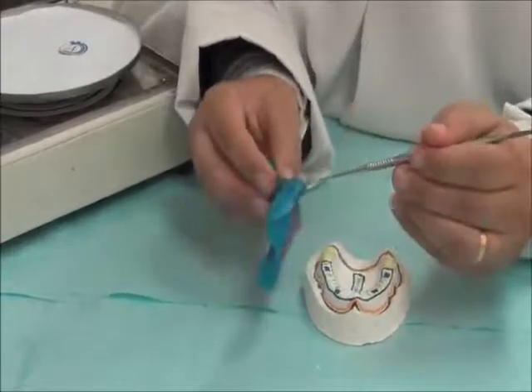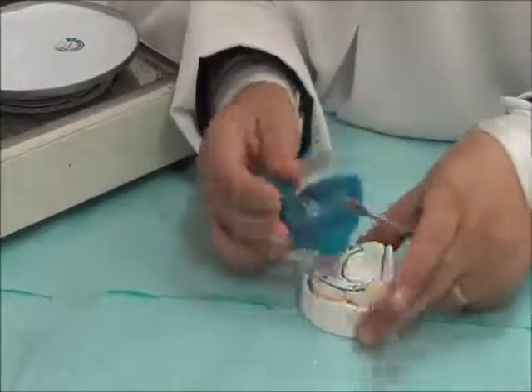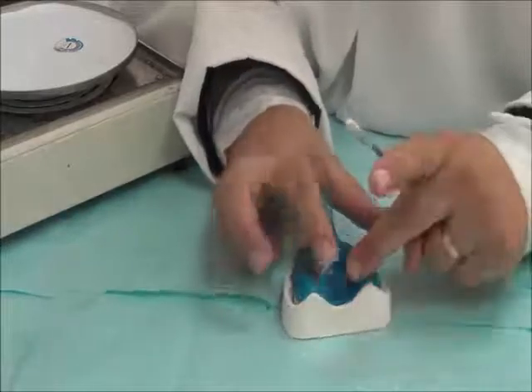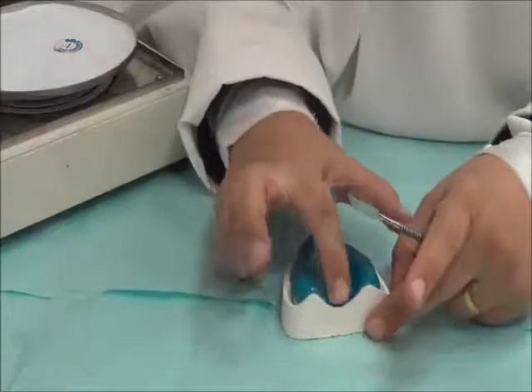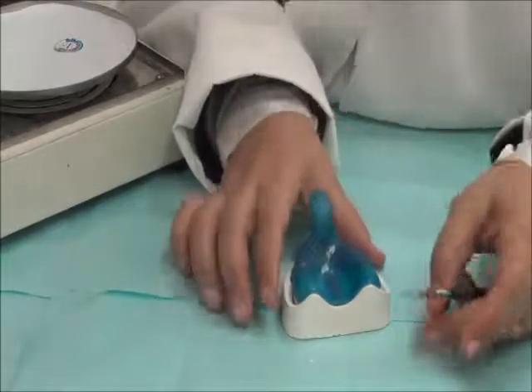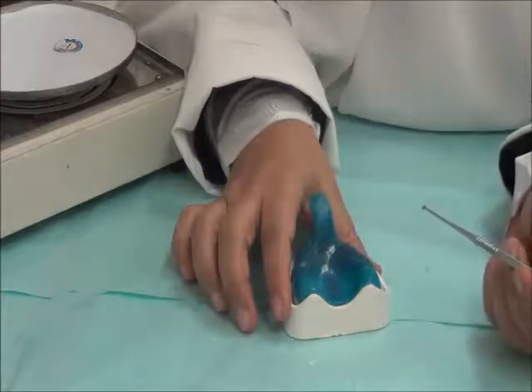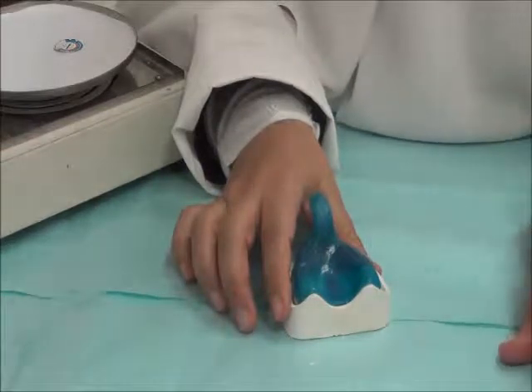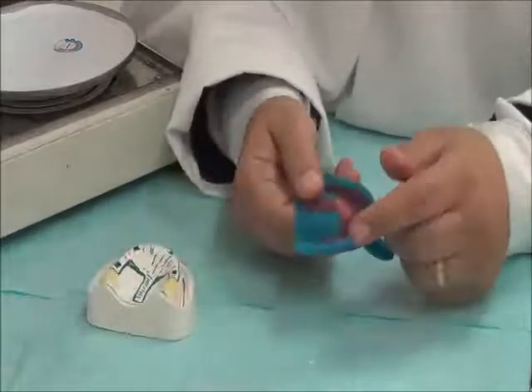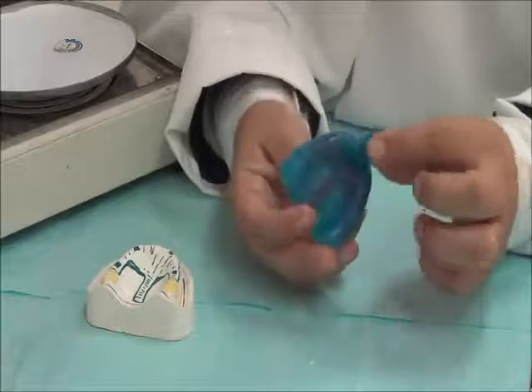The borders are fully cured, the handle is fully cured, and these borders follow the border shape we had in the beginning. And notice that the adaptation of the tray in this case is fully adapted. Not a lot of shrinkage happened because we covered the palatal area and reduced the shrinkage during the setting. Once we remove this, this is ready to be trimmed, smoothened, and then polished all together.